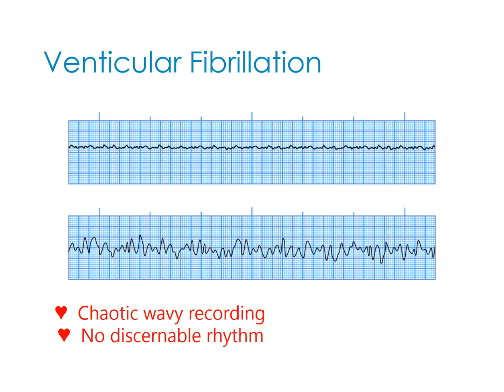So here is pictures of ventricular fibrillation. The top one is like a fine VFib, and the one below is a coarse VFib. Okay, if you look at the bottom one with the coarse VFib, remember with your ventricular tachycardia, your QRSs are wide and bizarre, but they're all pretty much the same. Where if you look at this with the fibrillation, again, think of a bowl of Jello just shaking, and that's kind of what those ventricles are doing. So that's why it looks like this. So there is no uniform way. It's just very chaotic, and there is no discernible rhythm.